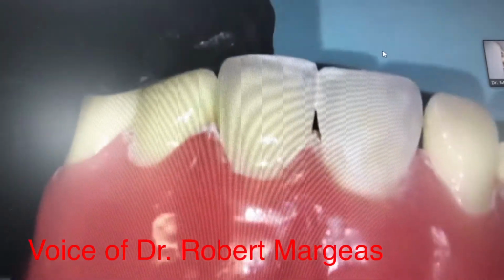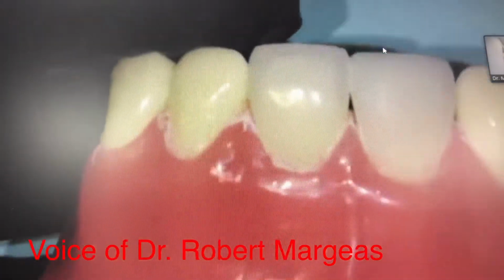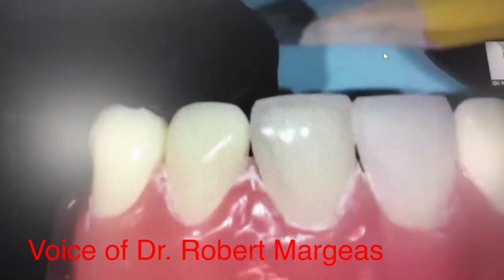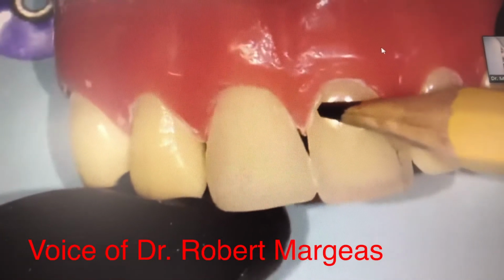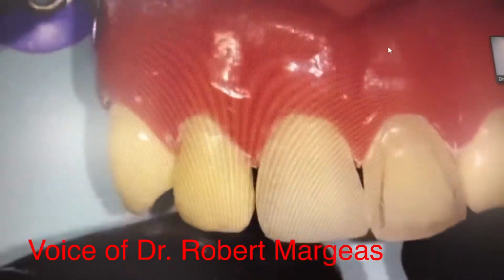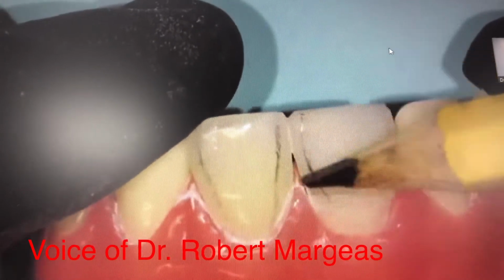So once I get to this point here, I can do this. I use the side of the pencil and I let the pencil draw where the line angles are on the adjacent tooth. It's the height of contour like this. So if you want a tooth to appear the same width, then I do this. I'm allowing that to draw in.